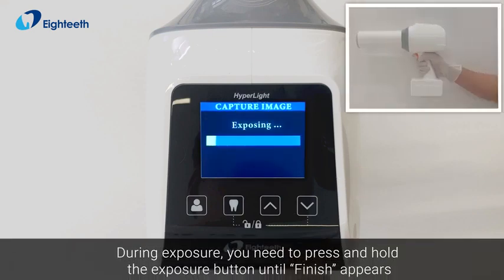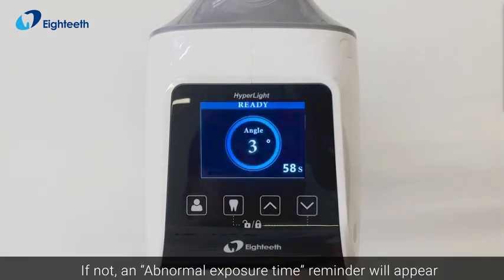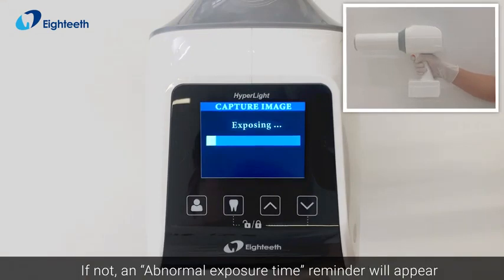During exposure, press and hold the exposure button until 'Finish' appears. If you do not hold it long enough, an abnormal exposure time reminder will appear.